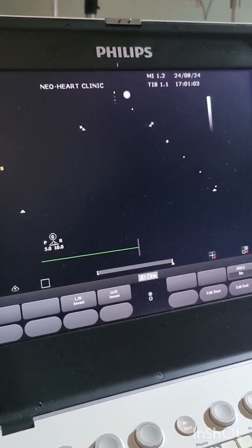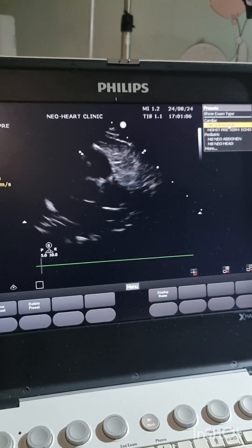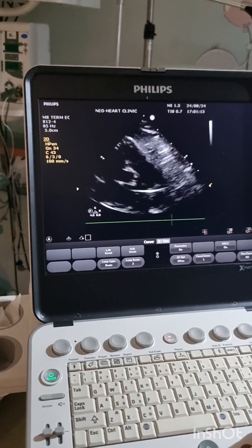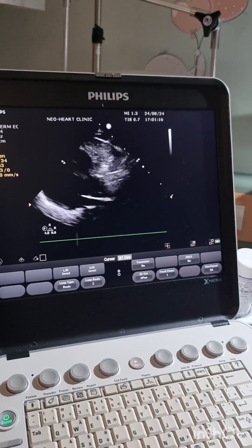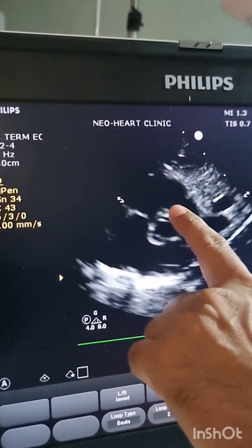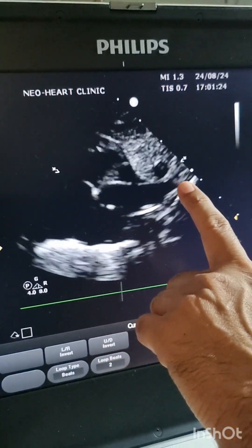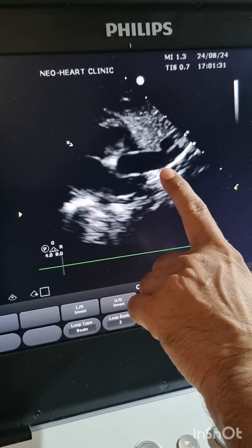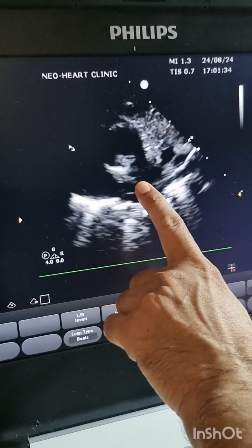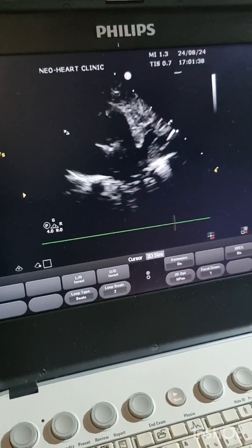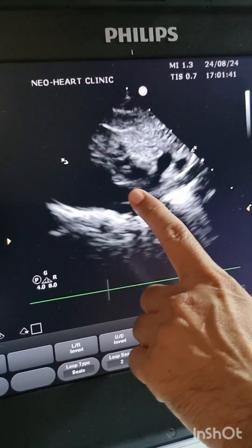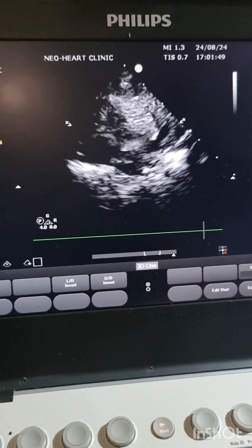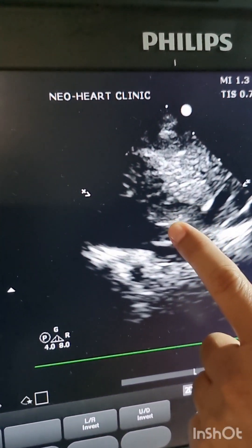When we keep the probe on the left just above the nipple line, you will first see the aorta in cross section. If you sweep the probe towards the right, you will see the aorta in longitudinal section, and when you sweep more to the right you will see, just below the aorta, the SVC entering into the RA.